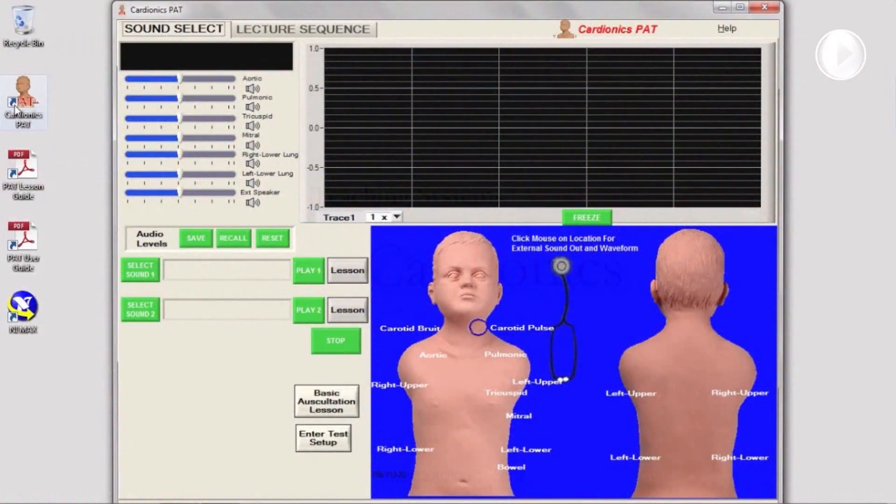The PAT software has two main sections: Sound Select and Lecture Sequence.